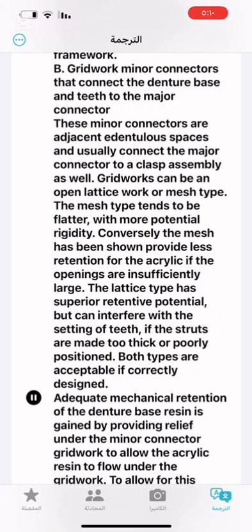for that purpose. A stabilizing component on one side of the arch may be placed to resist horizontal forces that originate on the opposite side. This is possible only because of the transferring effect of the minor connector, which supports that stabilizing component, and the rigidity of the major connector.